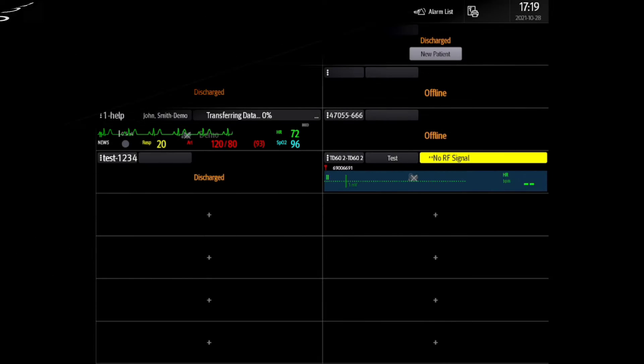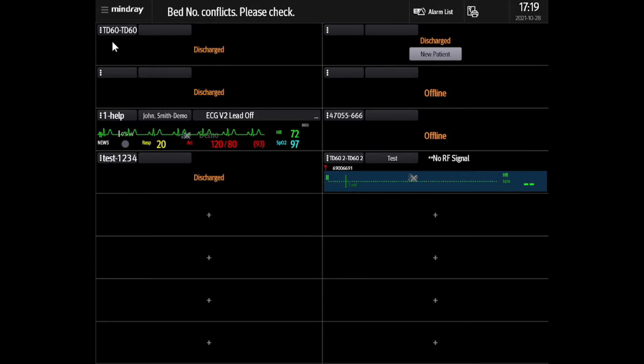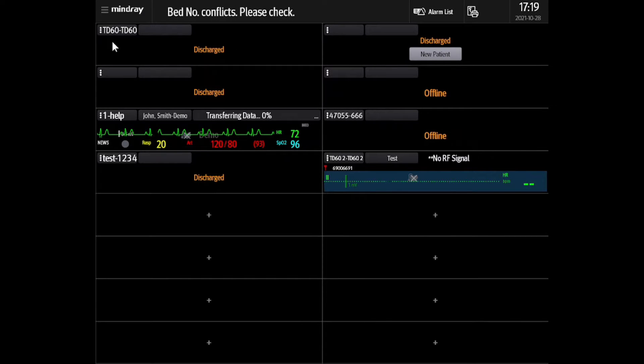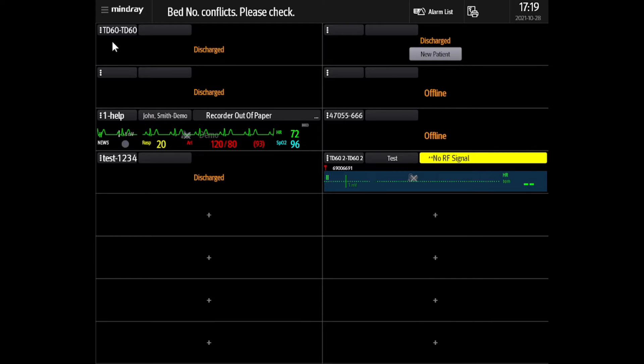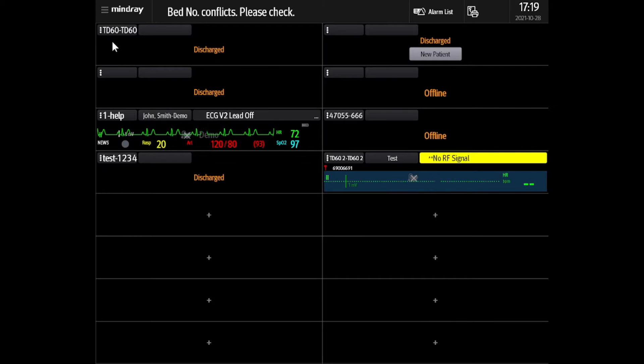To begin, we must first remove the problematic TM80 from Benevision. Select the Mindray drop-down menu located in the top left corner of the screen.